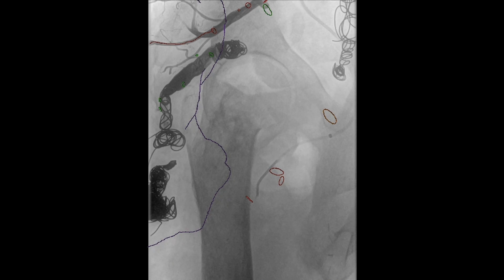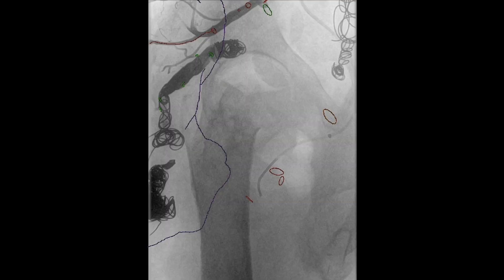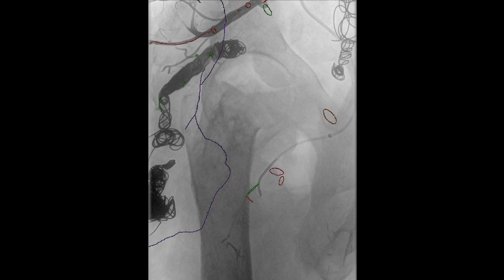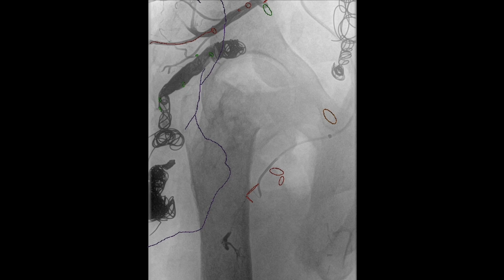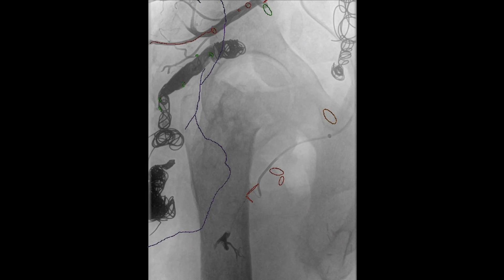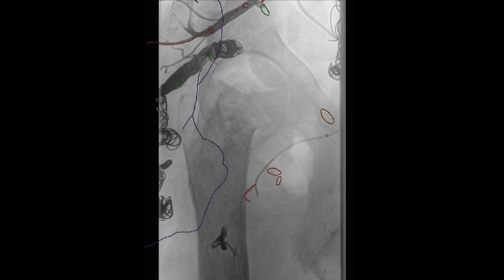In this portion of the case it's predominantly onyx. The main catheter will be pulled back while the micro catheter remains. You can see that little radiopaque marker further down representing the micro catheter tip — micro catheters are difficult to see.